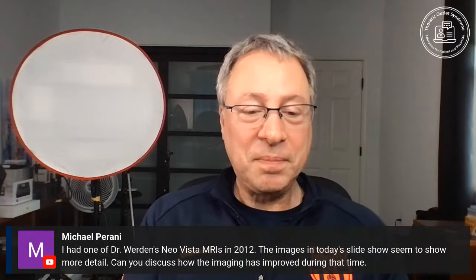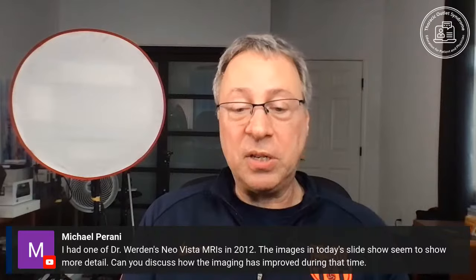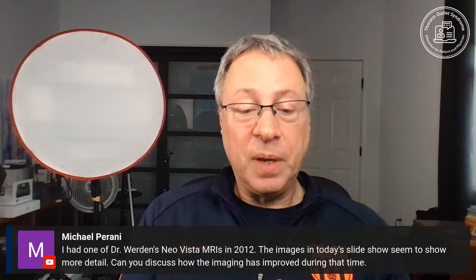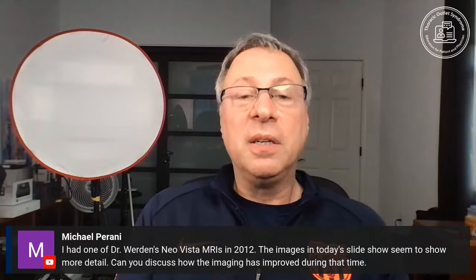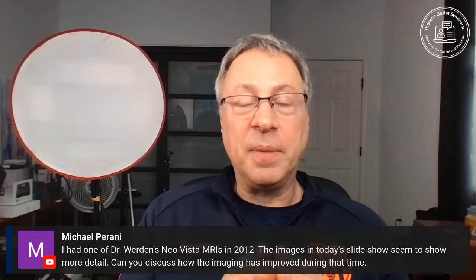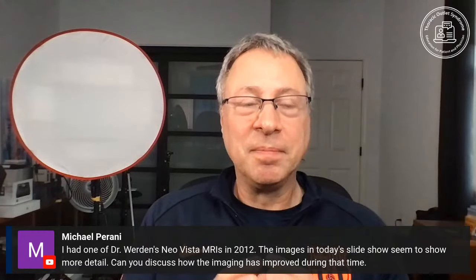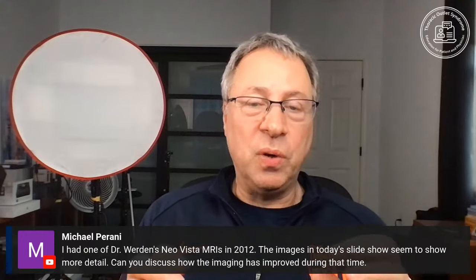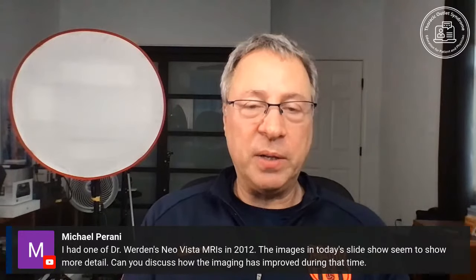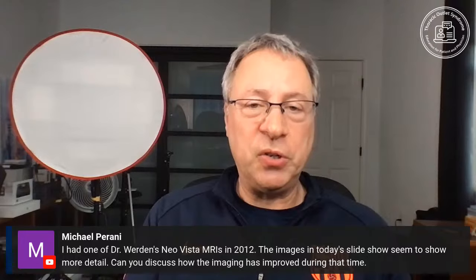Just got a new one. I had one of Dr. Werden's Neovista MRIs in 2012. The images in today's slide seem to show more detail. Can you discuss how the imaging has improved during that time? Thank you, Michael. The refinements we made over time, without getting too technical, are that we've worked with our partners to change the amount of time for each sequence, which allows us to get higher resolution. We've also changed some of the MRI parameters to help separate out the different soft tissues.